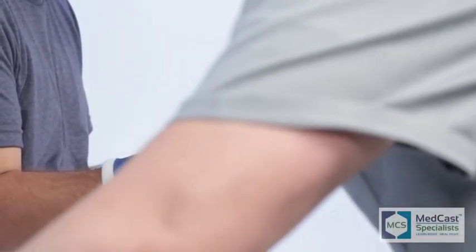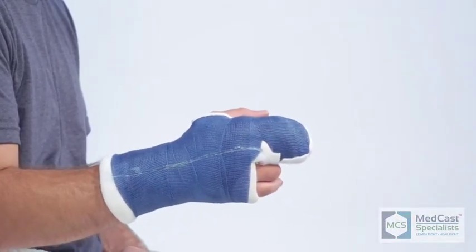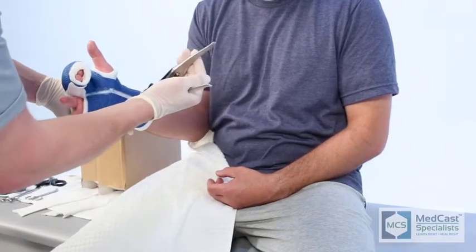You can always pull the digits out of the radial gutter portion of this cast. It's a lot better than trying to do a clamshell in the opposite direction.